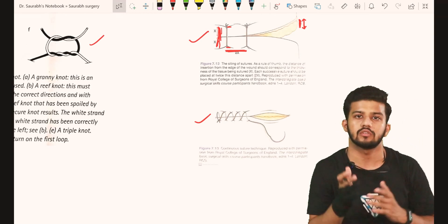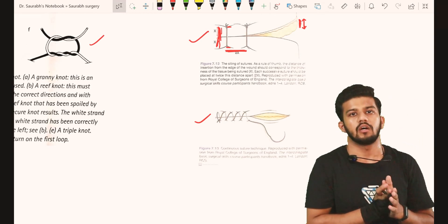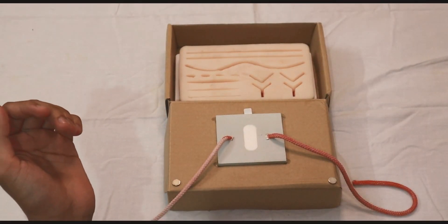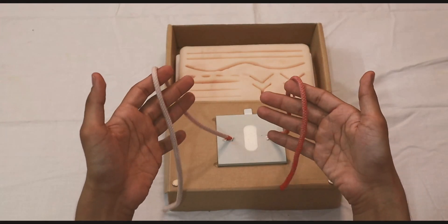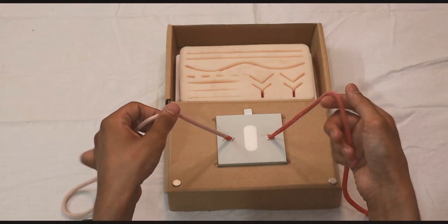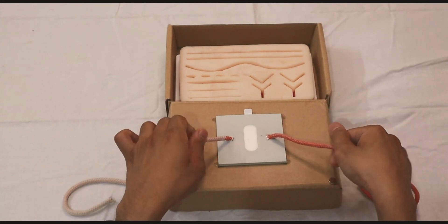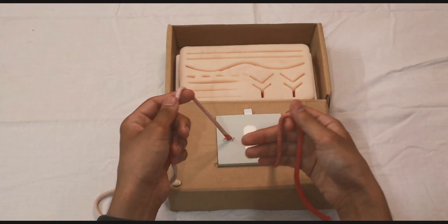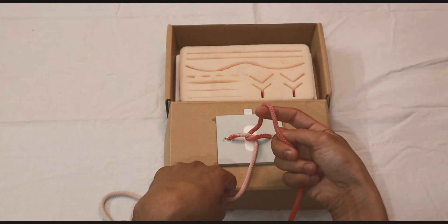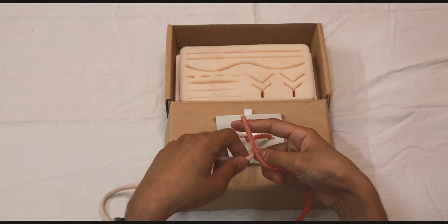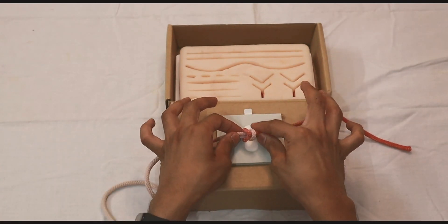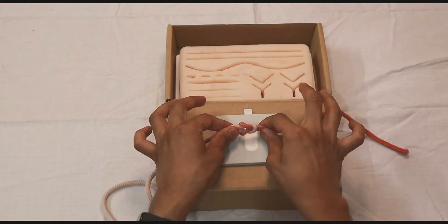Now we are going to talk about two very important knots in surgery: the reef knot and the granny's knot. The reef knot is also called the square knot. We give two throws using two different methods. The first is the middle finger method, where we make a loop around the middle finger and grab and tighten it. The second is the index finger method, where we make a loop around the index finger and grab and tighten it.